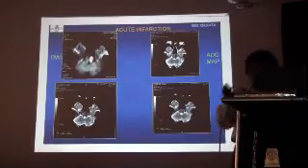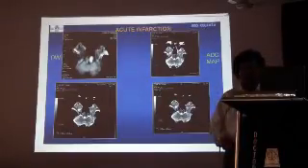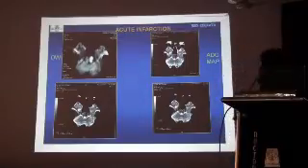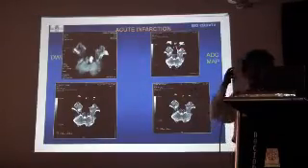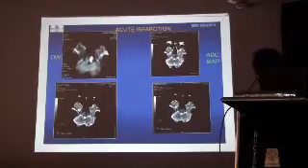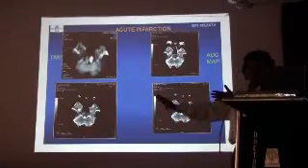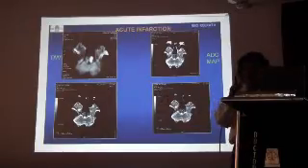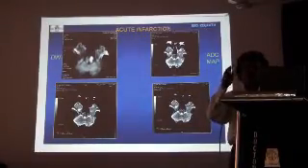And simultaneously, this should be combined with apparent diffusion coefficient or ADC. It will be just inverse. If diffusion is positive, go for ADC method. Same section, ADC. Just reverse. If it is hyperintense in diffusion, this should be reverse. If it is diffusion negative, no need of ADC method. Okay? So diffusion positive equals hyperintense or T2 shine-through appearance.